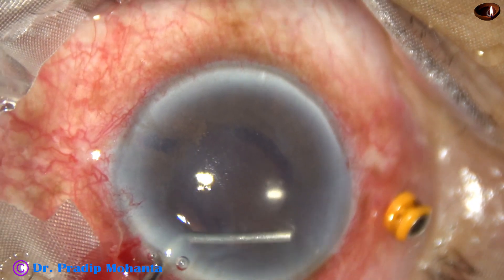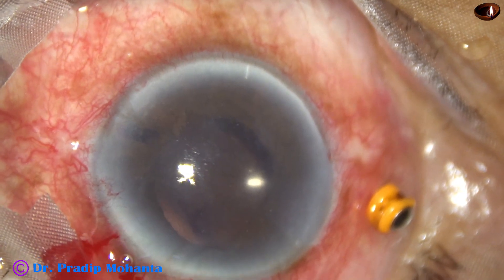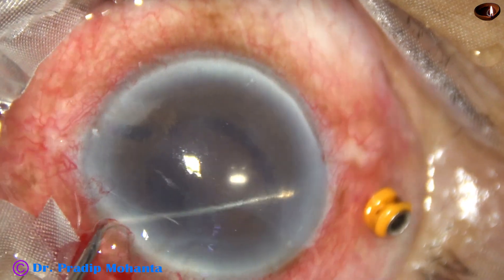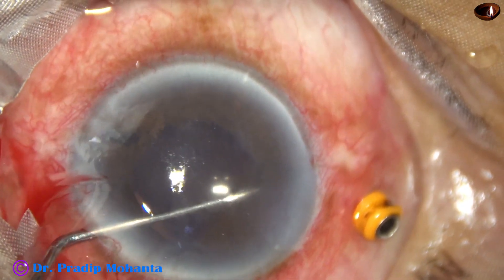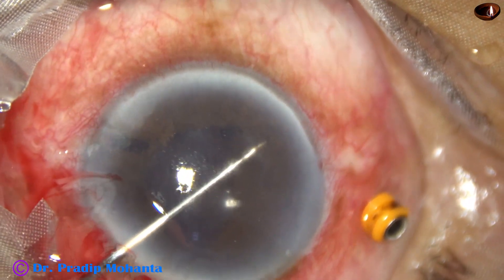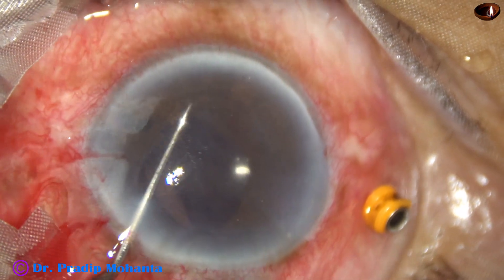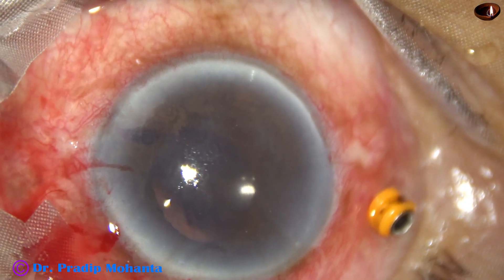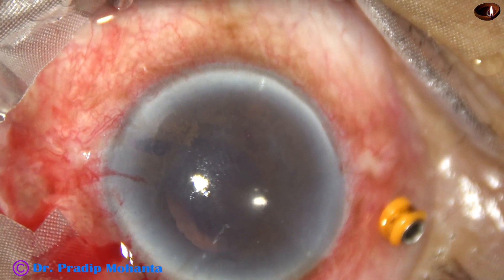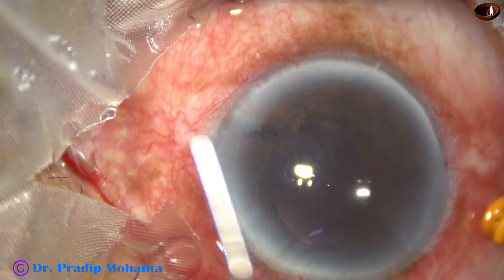I take the hook and gently pull the iris towards the center. The iris is being separated from the cornea. Till now the iris was plastered to the back surface of the cornea.